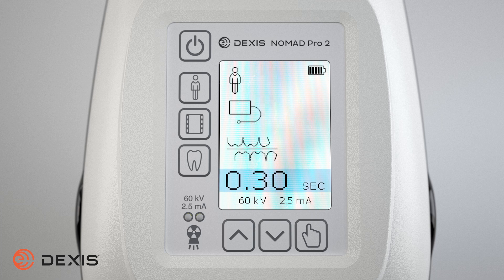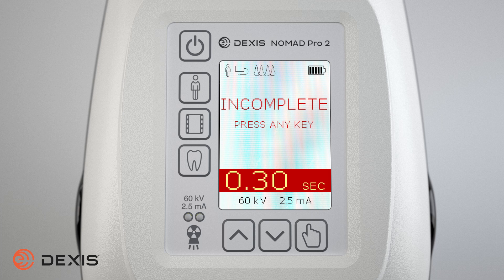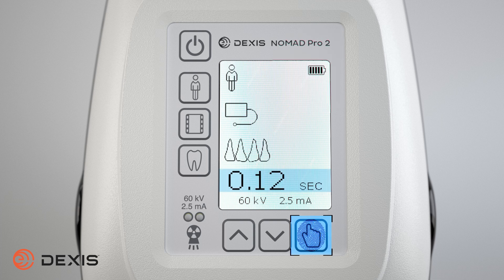If you release the trigger before the x-ray completes, the display will indicate incomplete. This means the trigger was not held for the appropriate amount of time and the exposure was not completed. To clear the incomplete message, press any button or power the Nomad off and on.